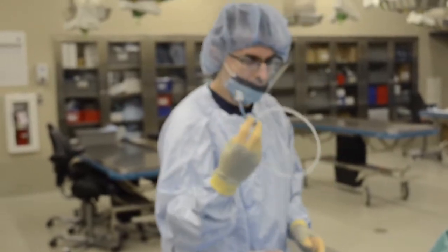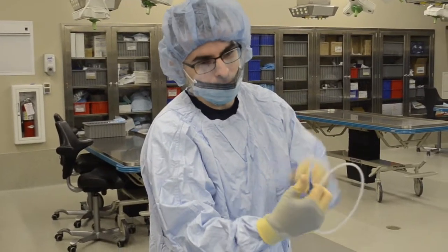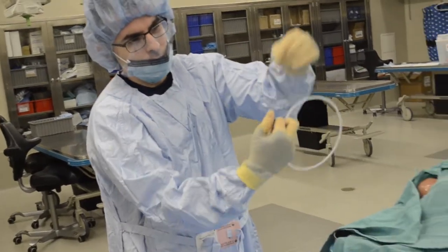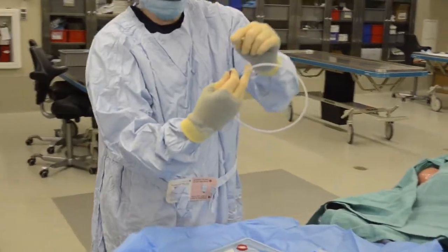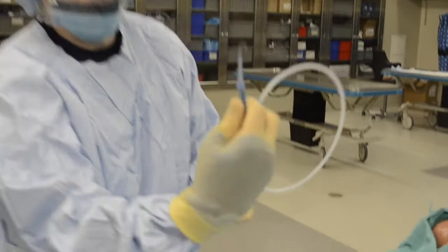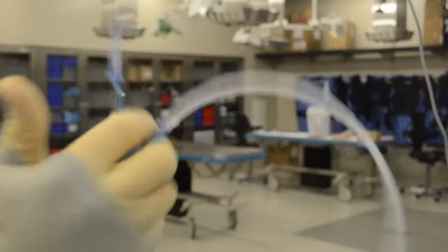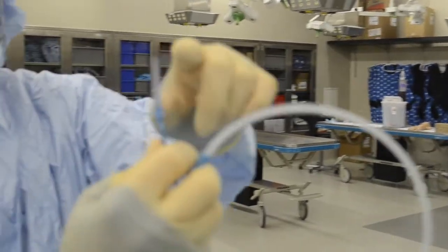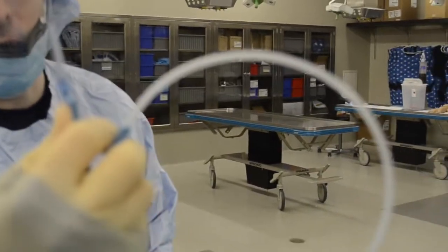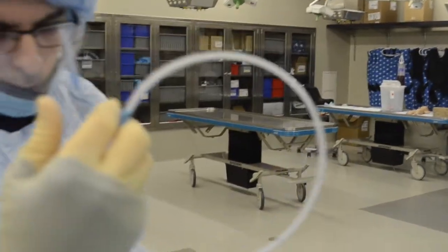The next thing that we use is the wire. So your wire comes like this, and there's a little cap on the end. So we need to get it ready. The first thing we do is we take off this cap. This little point here is called the J-tip. So we want to straighten out the J-tip. I do that with my thumb. I pull down. And now, just a little bit is extending, and then it can go back out. Now the wire is ready for use.